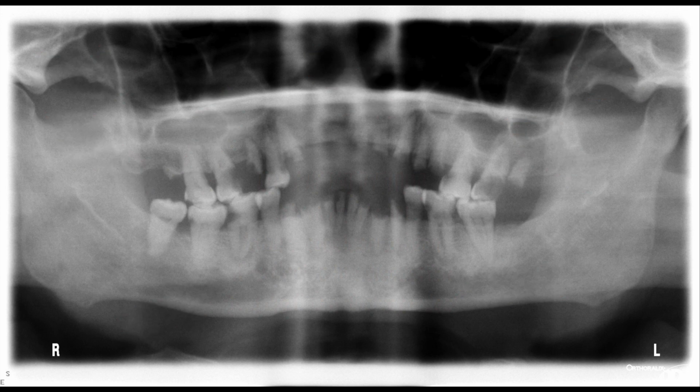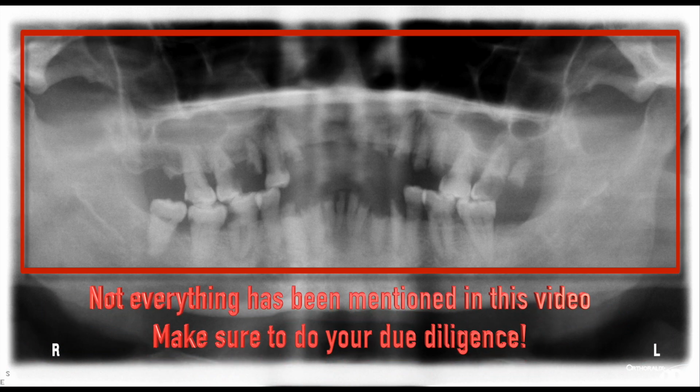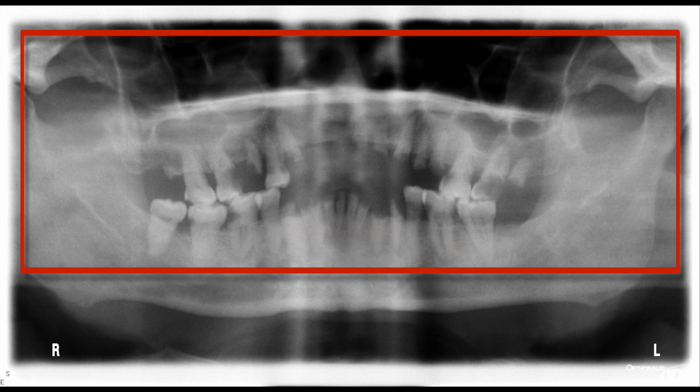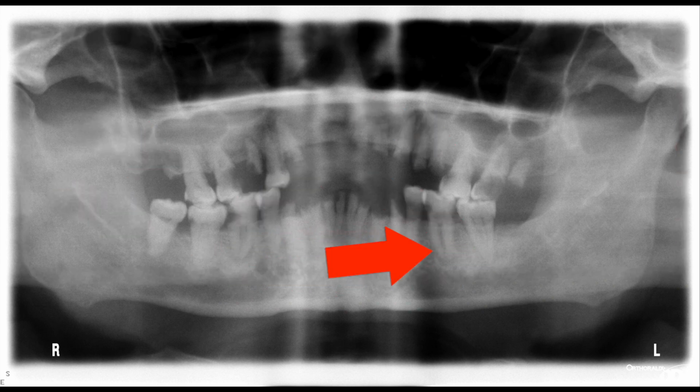And now I want to discuss how I would treatment plan this extraction and what I'm looking at. So I attempt to look at the big picture and then take a look at the little picture and take a look at the big picture again. The big picture is conical roots, first and foremost, for most of our molars, which is good. Number 19 may pose an issue. Number 30 may pose an issue. And then we look at the little issues. I go one by one through all the teeth.